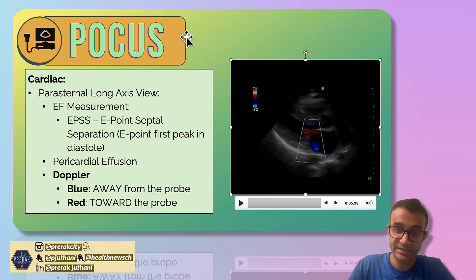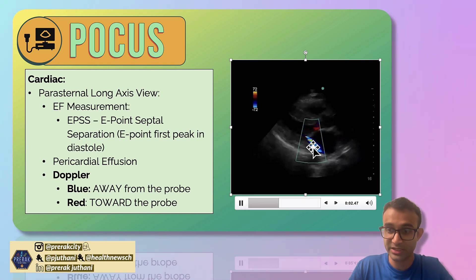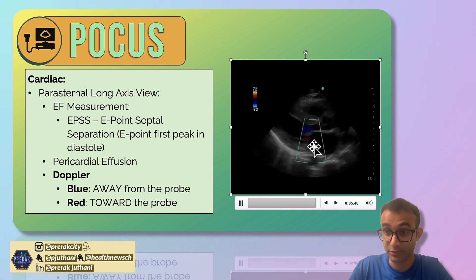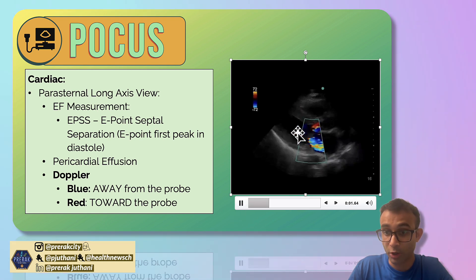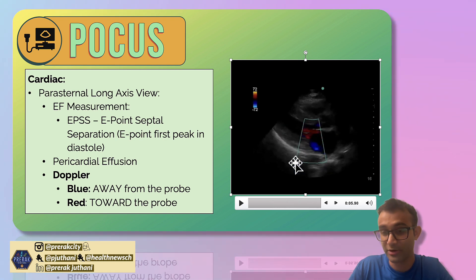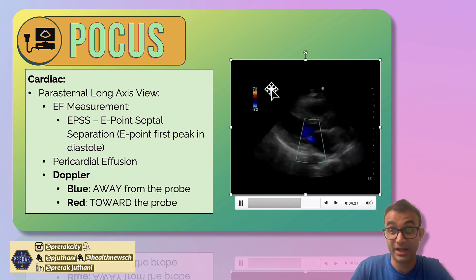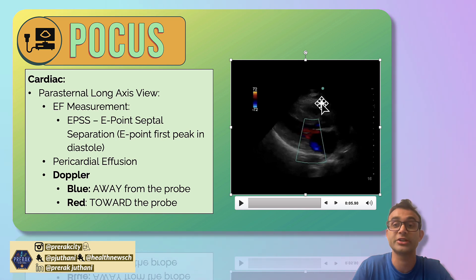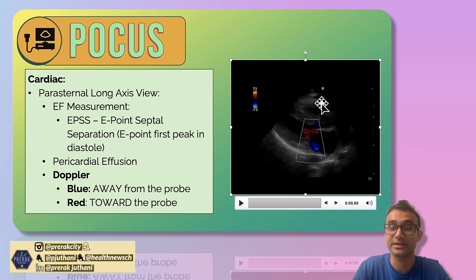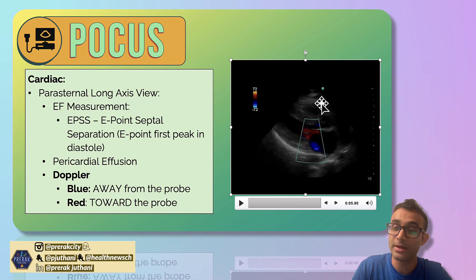Here is a real-life Doppler example. You can see a regurgitant jet moving backwards — when most blood flow should be going forward and the ventricle is contracting, much of that blood should be leaving forward through the aortic valve, but here some of it is going backwards into the left atrium. This is a common cause of hypotension — mitral regurgitation. Acute mitral regurgitation is more concerning than a well-documented chronic case, and the remarkable thing is you might not even hear a murmur on these patients, but you can see it on echo.